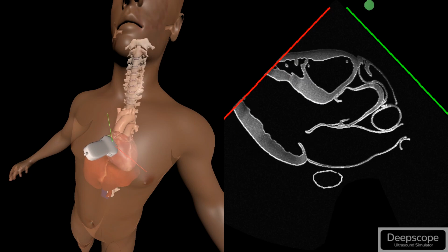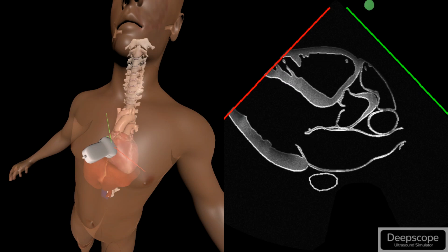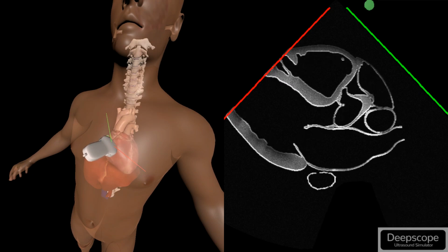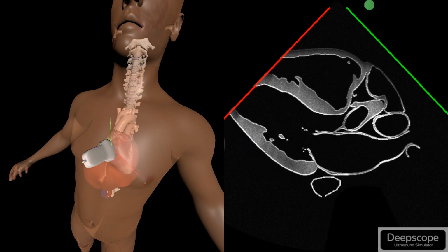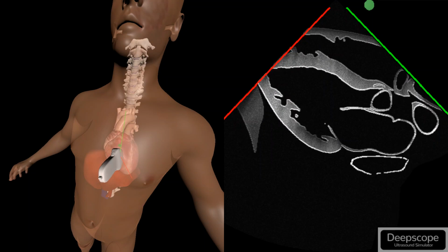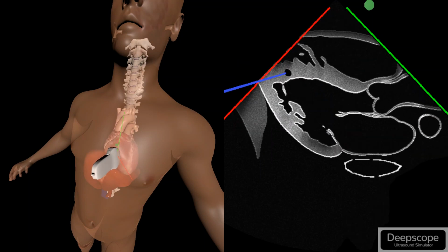And so what we mean by capping, if I look down, you can see that my dot is pointing towards the right shoulder in parallel to the long axis of the heart. And when that's the case, the LV is wide open. But when I cap, what happens is that I'm rotating my probe off axis. And suddenly we see this sort of capping or the sort of apex of the left ventricle.